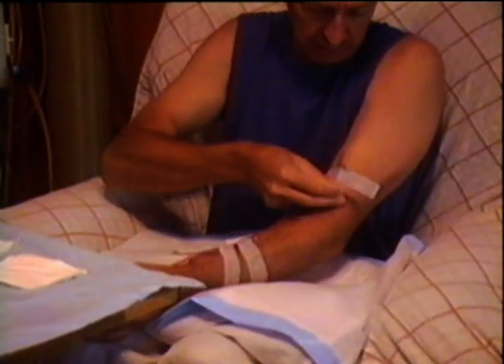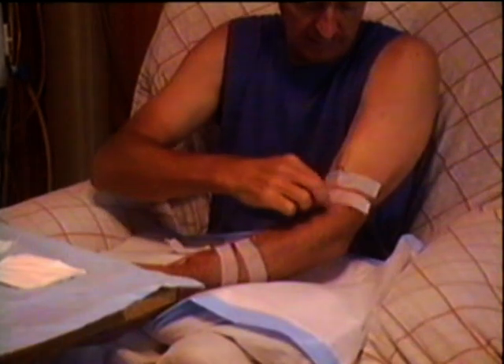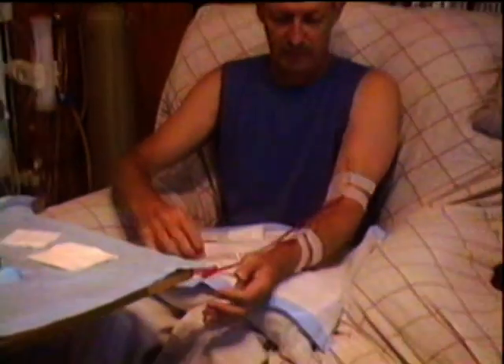I always put two bits of tape on here. Now my arm is ready for the blood to come out and for the blood to go back in. I'll get rid of those. Now I've made a big mistake here, but this was down when I started. That's sterilization — a bit of paper there.